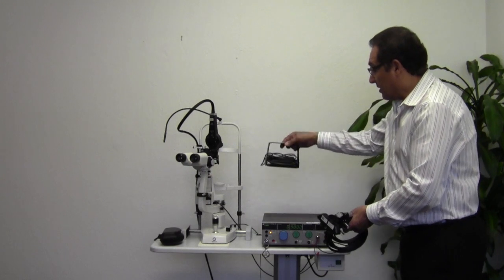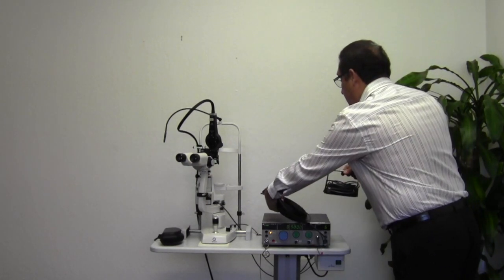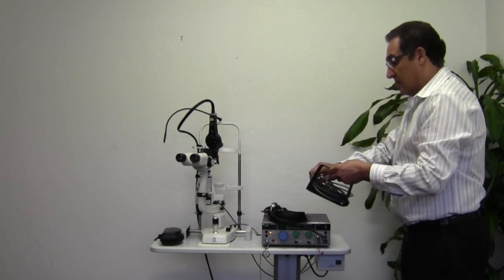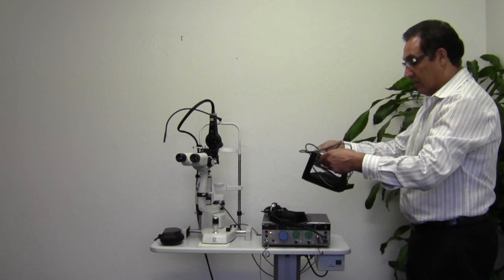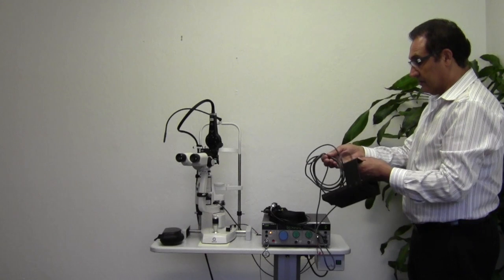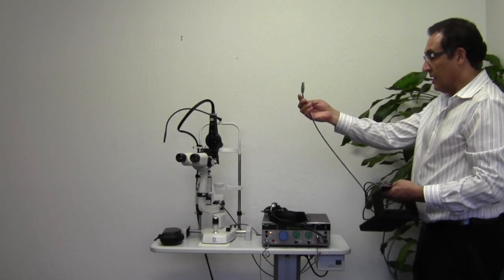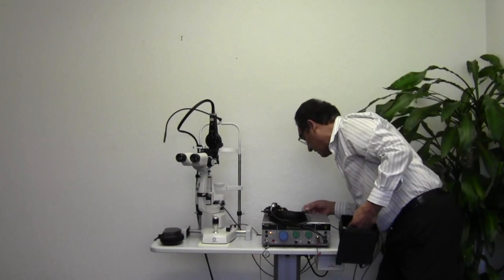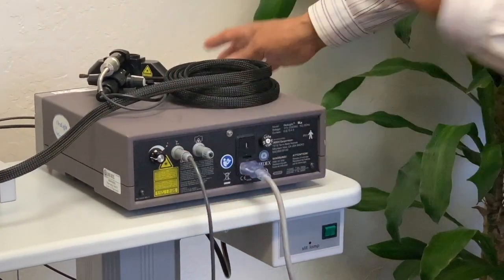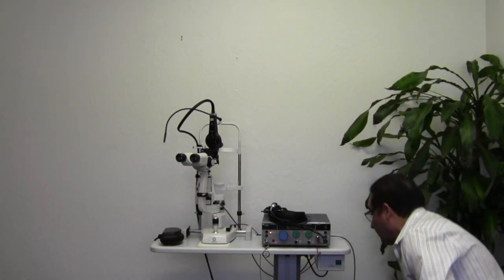I have to connect the foot switch. I will lay it down here and make sure it's safe. The foot switch has a plug, and this plug goes to the back of the laser where it's marked as foot switch — it clicks into place. This can then go on the floor.